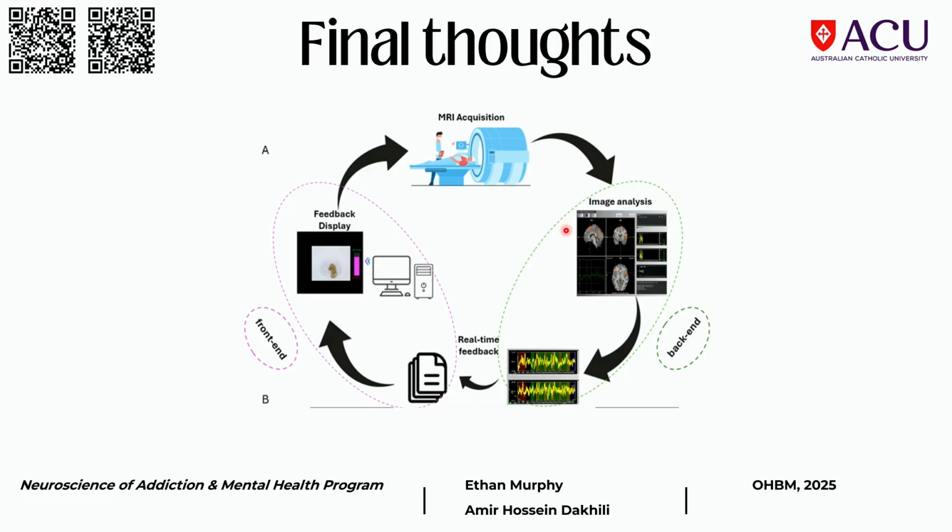Yeah, so the last one is more just to go back and reiterate the point that what we've shown is what can go wrong at the front end, but worryingly, there's a lot that can go wrong with the back end as well. So it's very important that everything, first of all, is in communication with each other. That's one of the key things. We have found the front end, we have everything set up. We think we're happy days, everything's perfect.